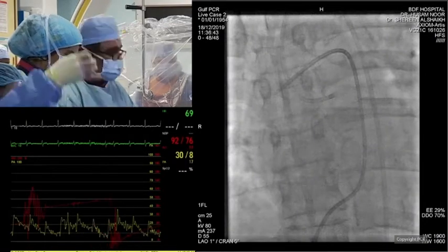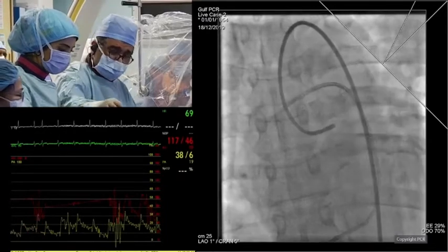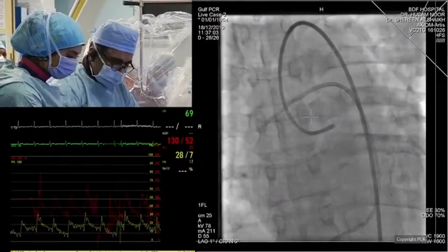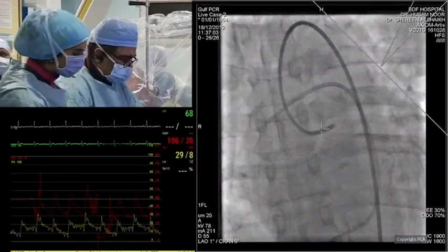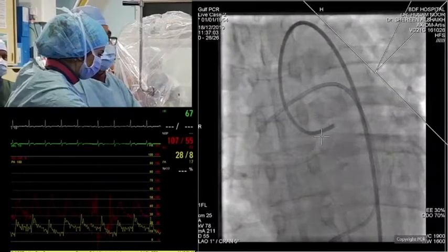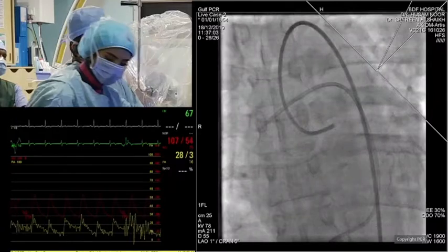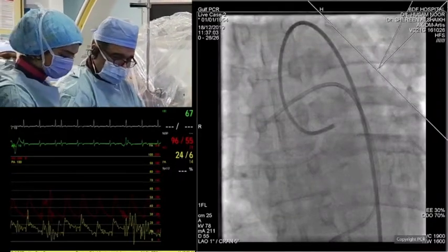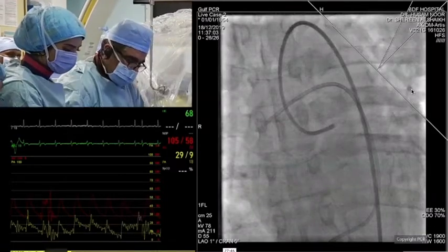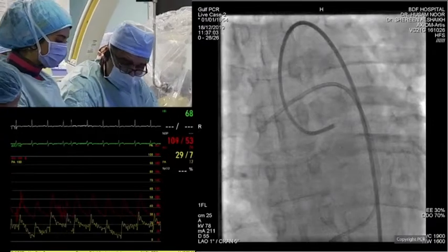So it's not only the collaterals, as Hassan has said rightly, and not only the ability perhaps to have vasodilation, but mainly the fact that you are using FFR in a situation where Nico Pijls and Bernard de Bruyne said, okay, well, forget about venous pressure, because it's normal. Let's imagine that it is normal. That is the whole framework of FFR in that particular type of patient. So we know that when you have high left ventricular diastolic pressure, high venous pressure, you have to be cautious.